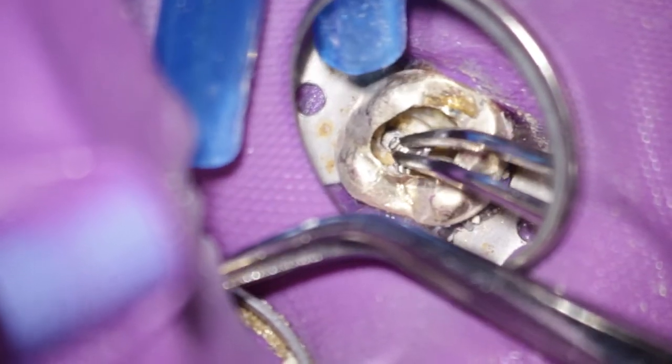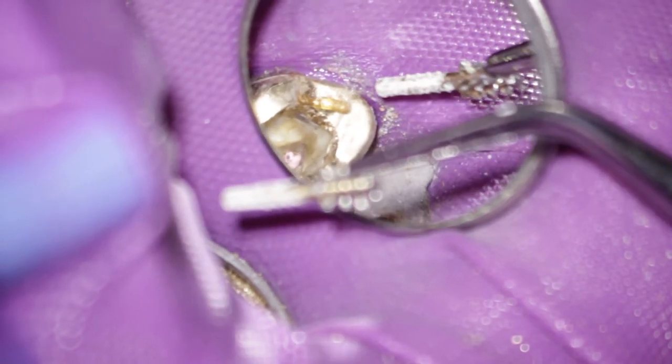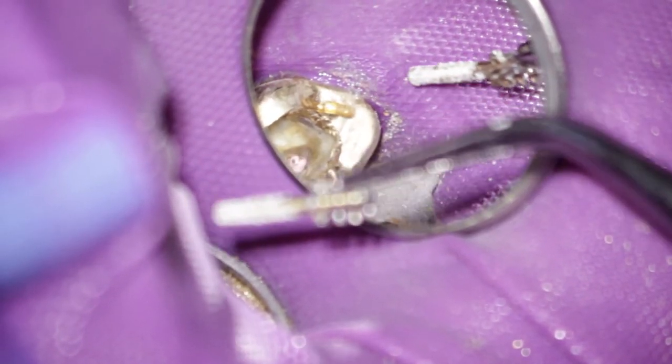You can see that it is totally free of resin at the wings in the next picture. Yeah, totally free. It was hard work, but worth the time because I have not caused any additional damage to the tooth.